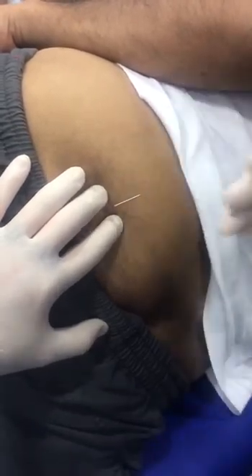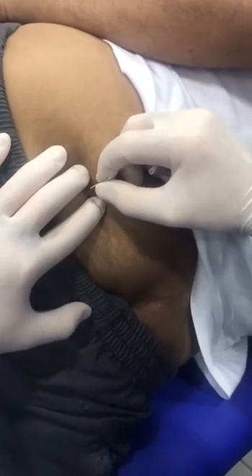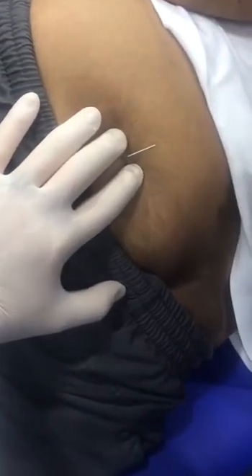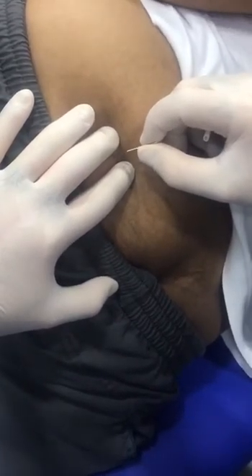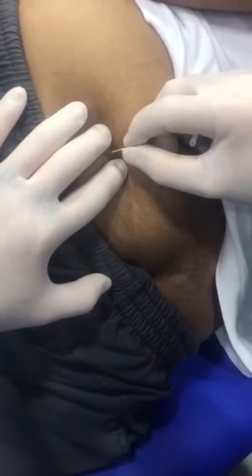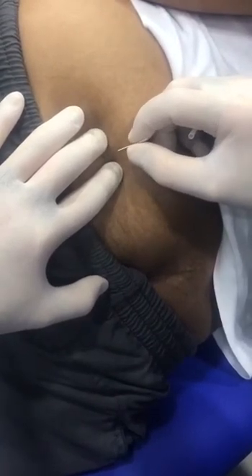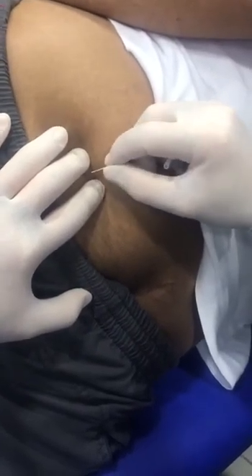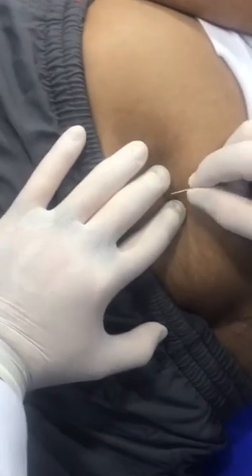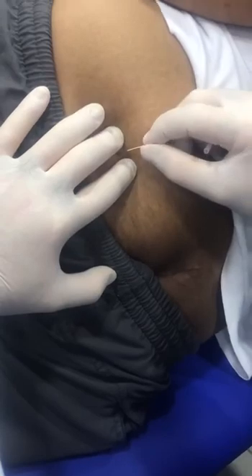If you have any doubt, you just change a bit. So for example here, what do you think? No. So this is apparently free. Okay, so I'm going to do this. Do you feel anything? No. I'm going to do it a bit lower. Let me know. No electricity? No. Here I felt it stiffer, the twitch. Here. Yes. Do you feel twitches? Yeah. Okay, here there are a lot of twitches.